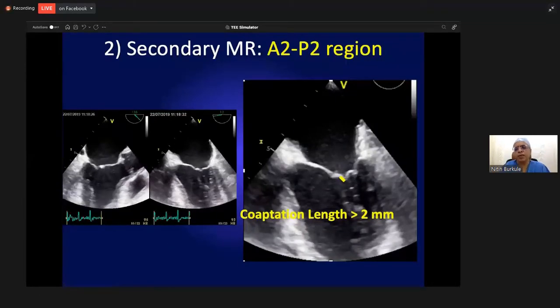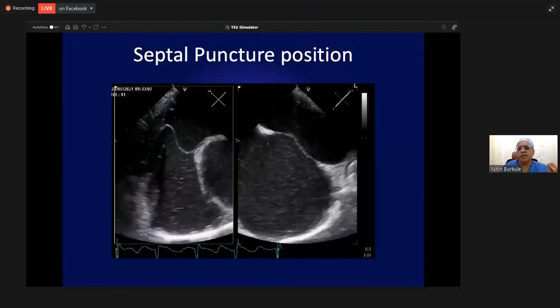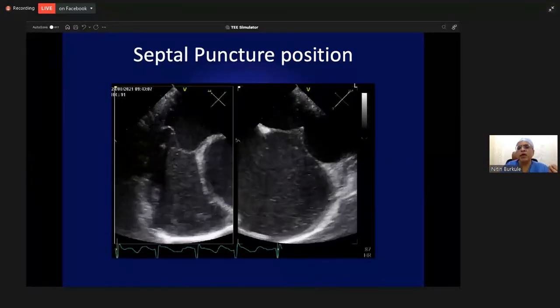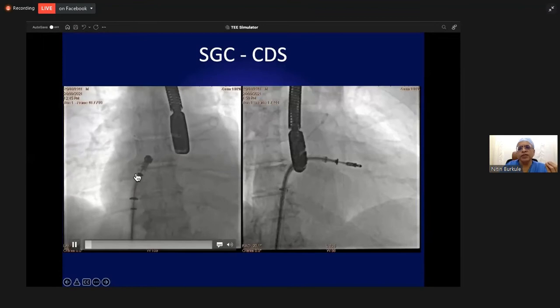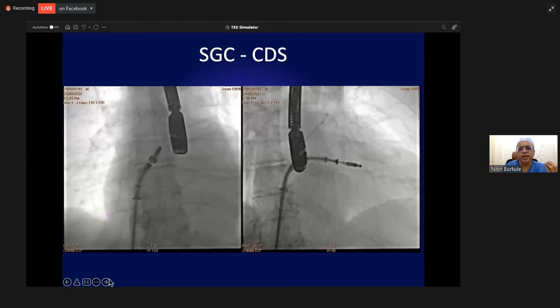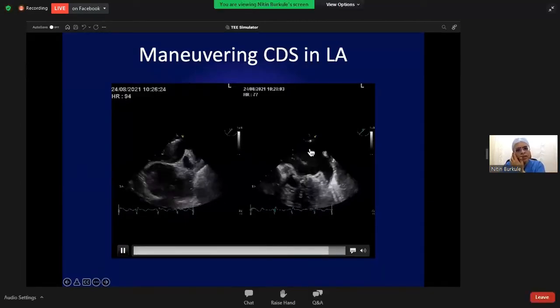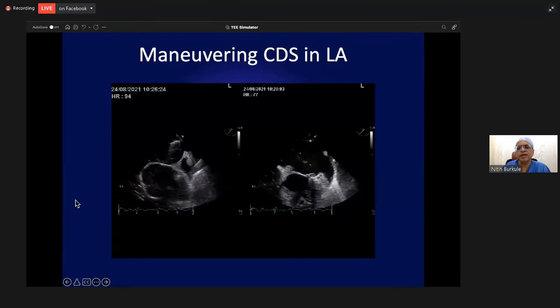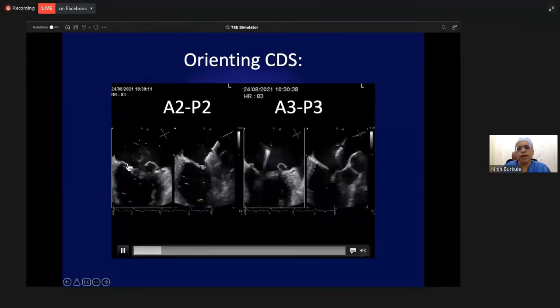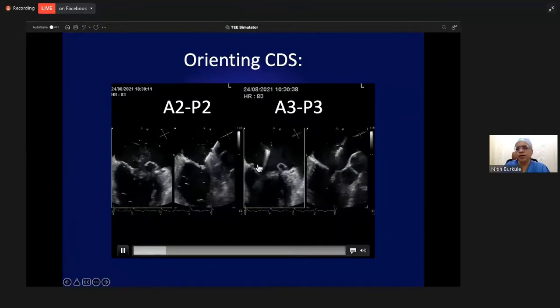Now the transesophageal echo becomes almost a centerpiece for this intervention because everything is TEE guided. As you can see, even the septal puncture is TEE guided because you have to be quite posterior and slightly superior. Then while you are positioning your steerable guide catheter or the clip delivery system, it is entirely under TEE guidance that you can tell the interventional cardiologist whether he is away from the LA free wall or close to the LA free wall so that he can safely steer it towards the mitral valve. When it is very close to the mitral valve, you can also guide the interventionalist whether you are at A2 P2 or deviated to A3 P3.